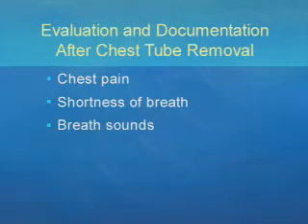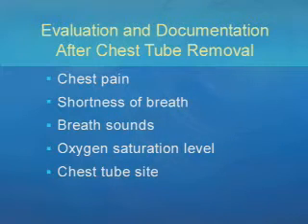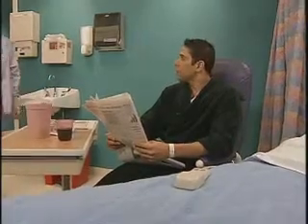Auscultate his breath sounds at least every 4 hours to check for diminished sounds. Monitor his oxygen saturation level to detect hypoxemia. Assess the chest tube site for signs of infection. And monitor chest X-rays for recurrent pneumothorax. Mr. Smith.